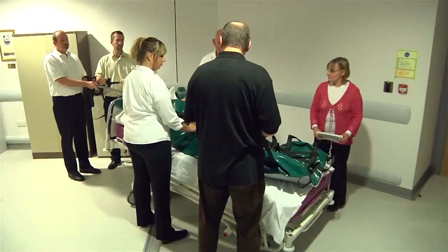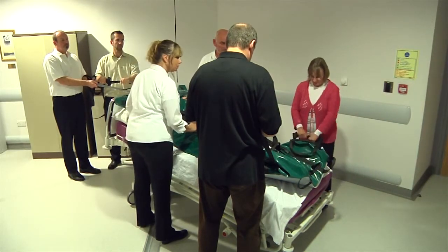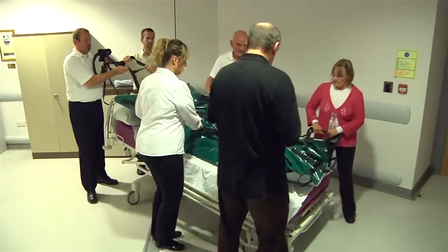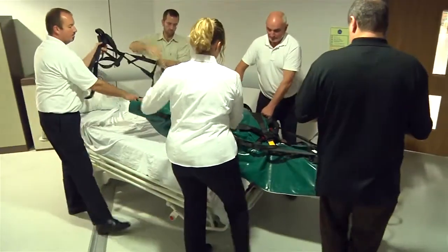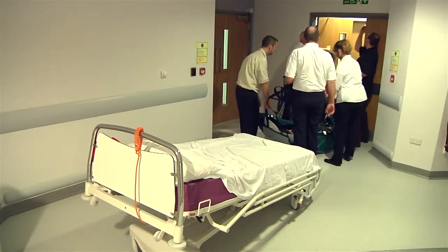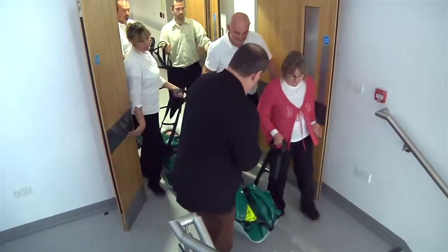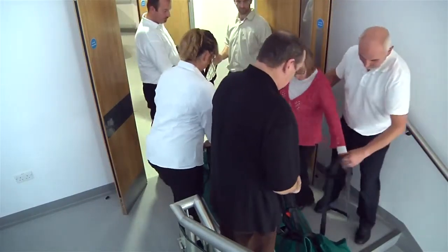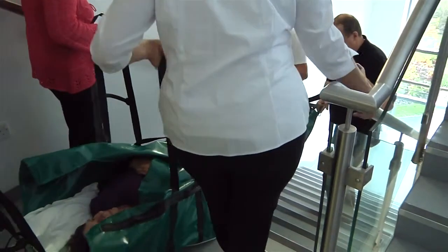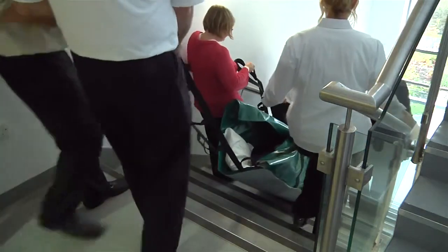Remove the foot end of the bed, lower and tilt the bed. Working together, slide the patient off the foot end of the bed. Be sure to protect the head throughout this procedure, particularly as the head comes off the end of the bed. Once the evac mat is on the floor, all available operators should assist in moving the patient towards the stairs. It is vital that the patient approaches the stairs feet first, so be careful to ensure that turning the evac mat around in a narrow corridor is not required. With operators distributing the weight between them, slide the patient down the stairs feet first in a controlled manner.